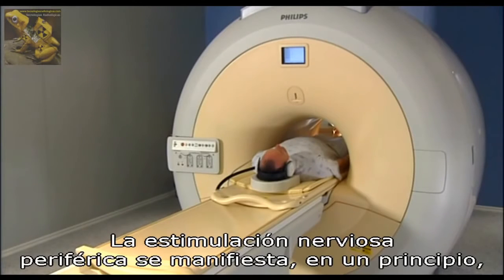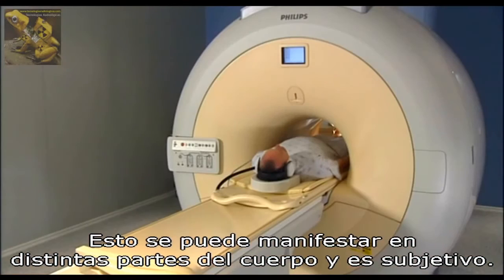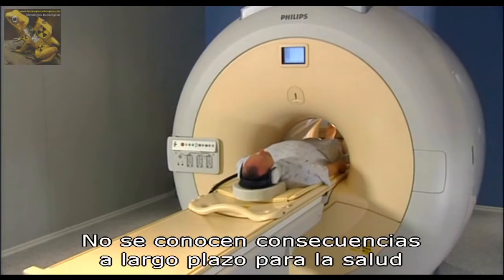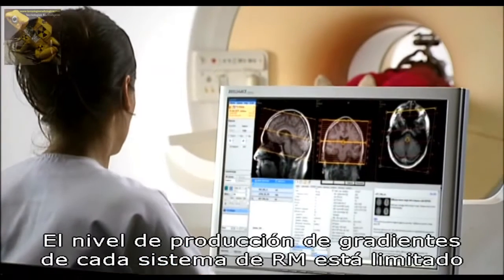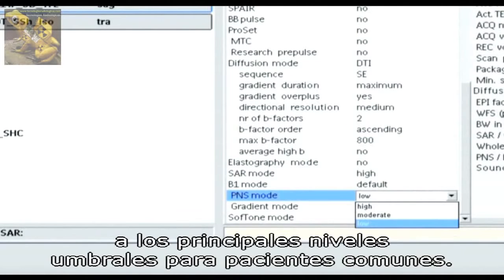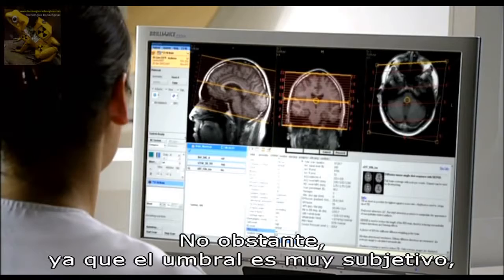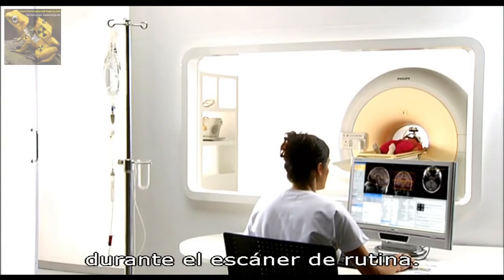Peripheral nerve stimulation is first observed as a slight contraction of the skin. This can vary considerably in position over the body and is very subjective; there is no known long-term health effect related to the nerve stimulation. The gradient output level of every MR system is automatically limited to values of the mean threshold level for patients. However, since this threshold level is very subjective, sensitive patients may feel some peripheral nerve stimulation during routine scanning.